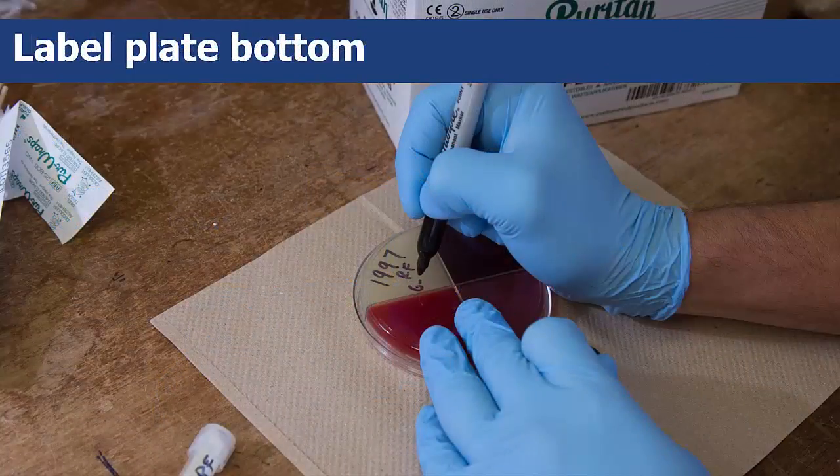Use your Sharpie marker to label the plate bottom with the cow's ID number, which quarter is being sampled, and the date you are taking the sample.